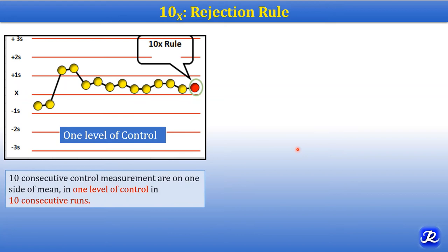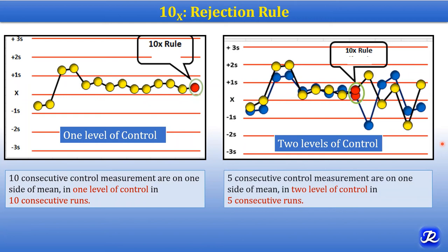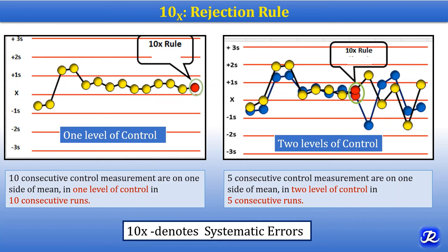In the 10X rule, if one level of control is used, ten consecutive control measurements on one side of the mean in ten consecutive runs violates the 10X rule — you can see here that ten consecutive runs have values on one side of the mean. When two levels of control are used, five consecutive control measurements on one side of the mean in both levels across five consecutive runs violates the 10X rule. This is a rejection rule that denotes systematic error.